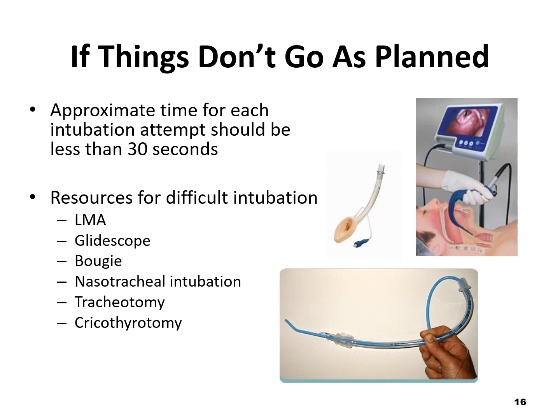So the resources that we can use for those difficult intubations, the first one is an LMA. This is a laryngeal mask airway. It is considered a supraglottic airway. It is a temporary measure. Often it's used in the OR for short cases, and sometimes they have LMAs that can be intubated if the case becomes longer, so they can actually put an endotracheal tube through there, or a stylet to allow an endotracheal tube to be placed.